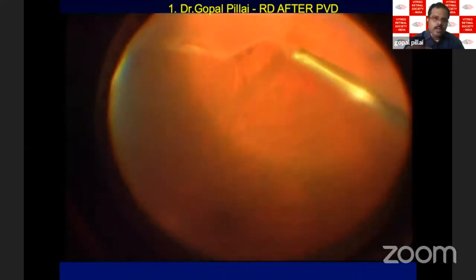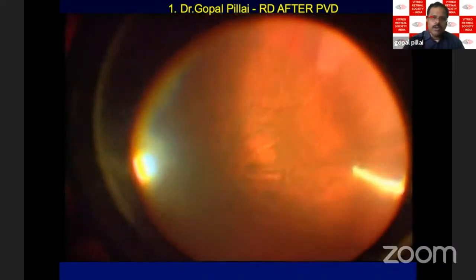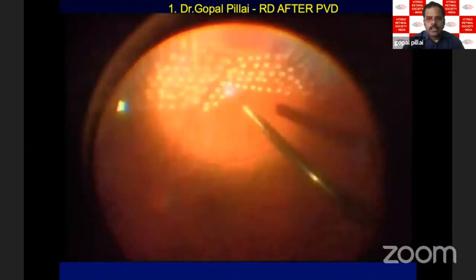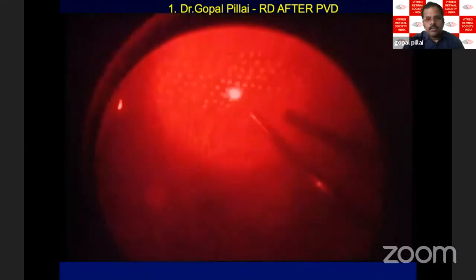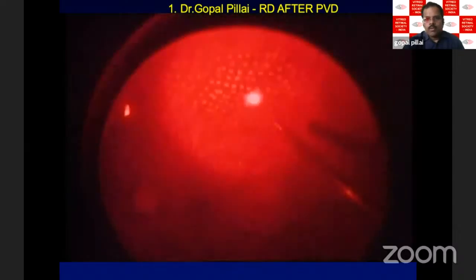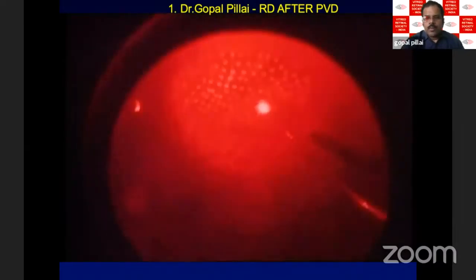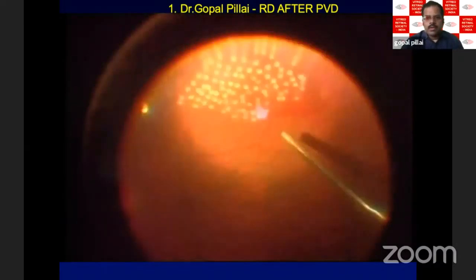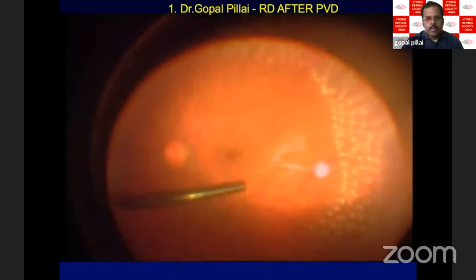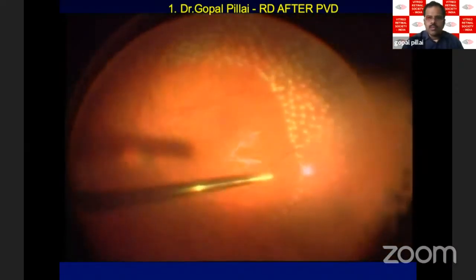You had to go all over and do a vitrectomy right to the periphery, clearing all the vitreous which is anterior to those tears and removing all the traction on the area of the tears. Then finished with laser. I did a little more laser. Usually we do about 3 or 4 rows, but I had a heavy laser here. And the places which were quite anterior, those areas I cryoed. And once you finished lasering and cryoing, I put gas. And the final visual acuity of this patient after epiretinal removal was 6/12.